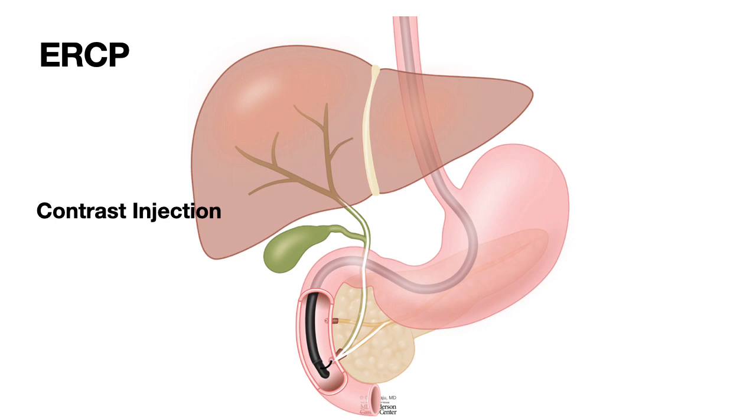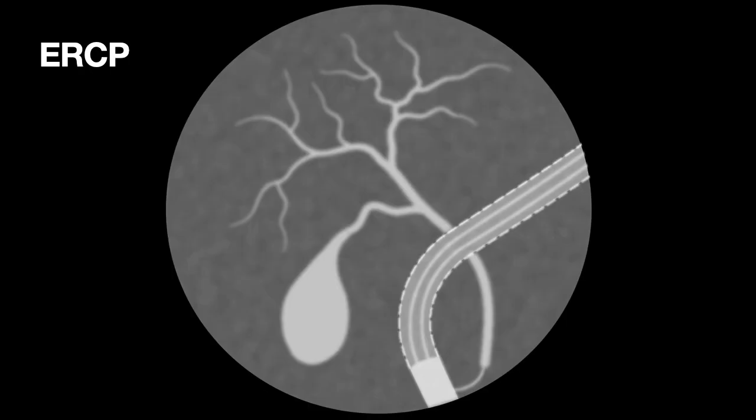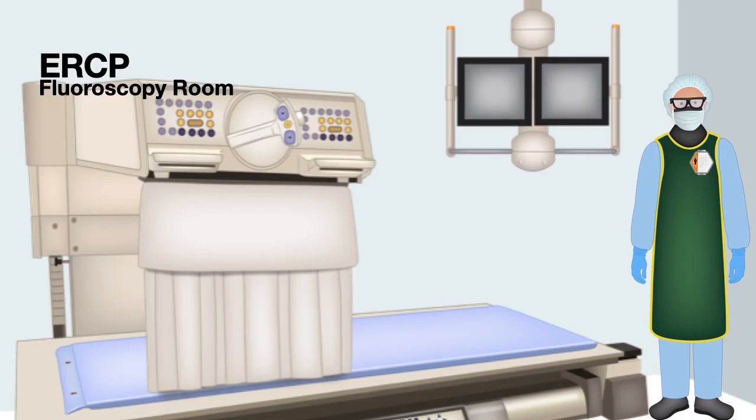And how do you see the contrast injection? You have to use an X-ray or fluoroscopy to check the contrast going into the bile duct and the pancreatic duct. And unlike regular endoscopy, which is either EGD, colonoscopy, and enteroscopy, which is performed in a regular room, for ERCP, you need X-ray control to see the injection of dye under X-ray or fluoroscopy. So we do the procedure in the fluoroscopy room.